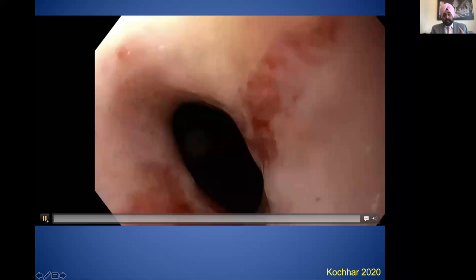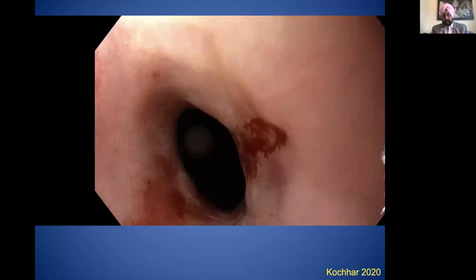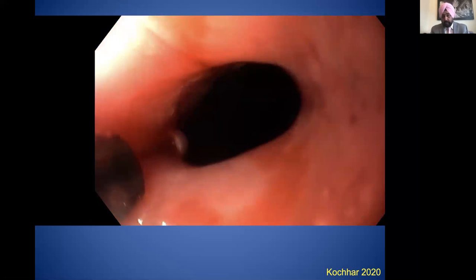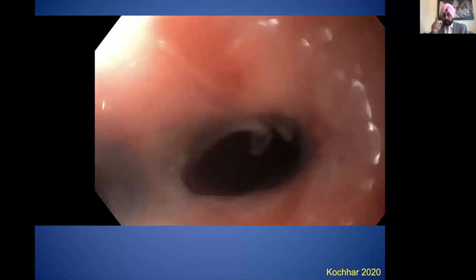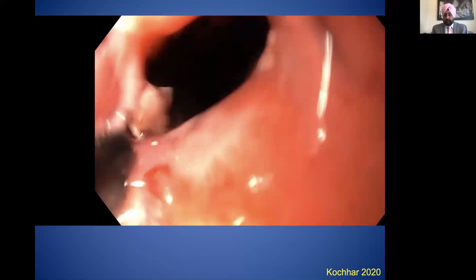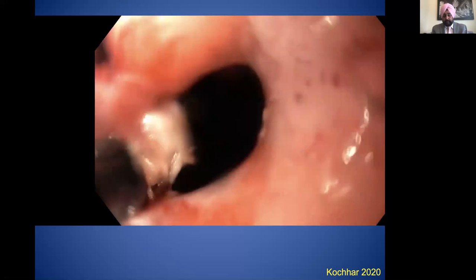Here we'll share a case with an anal stricture in a patient with PSC and UC who now has a J pouch. The stricture was so tight, you can't even do a digital rectal exam, and an upper EGD scope will not go through. We decided to perform stricturotomy, again using the IT nano knife. The key in this female patient was to cut on the wall opposite from the posterior vaginal wall. I do not like to cut on the posterior vaginal wall side, just in case there was more tissue damage from heat, there is a risk of causing a pouch-vaginal fistula, which can be very difficult to treat.